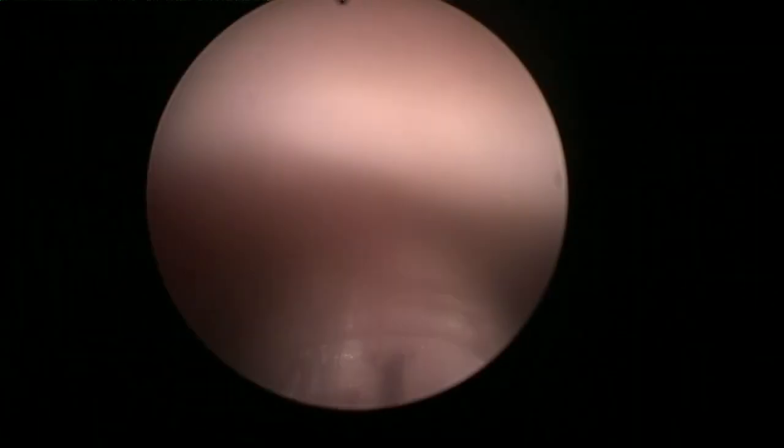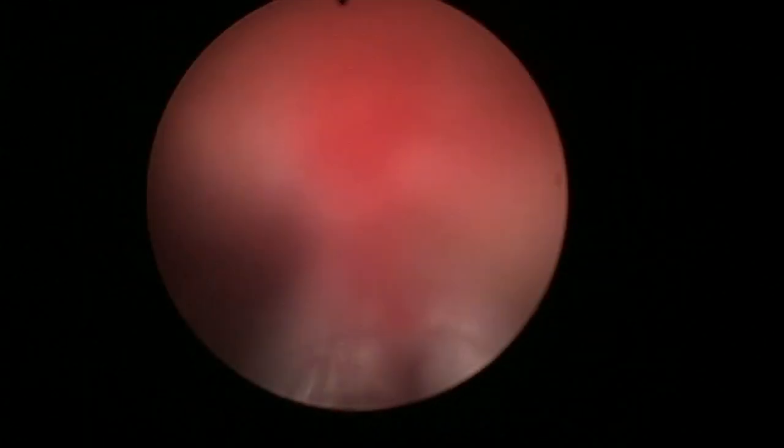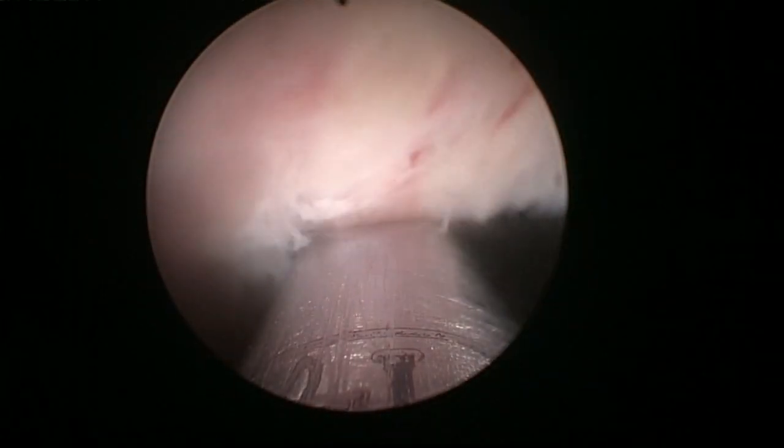I like to go below the adenoma. Typically, the water that comes out during the change of instruments, you fill it up again while getting ready to morcellate. So I close the outflow, I leave the inflow open, and I try to keep the bladder more or less distended. Here, I'm keeping the blade inside the bladder so I can see the adenoma on top and the two corners around the blade, which tell me that I am in the center of the bladder, more or less.